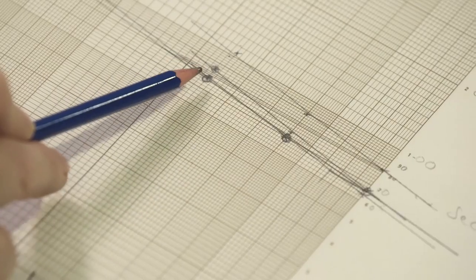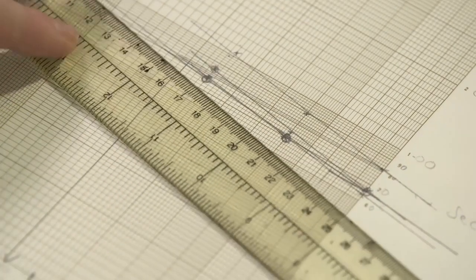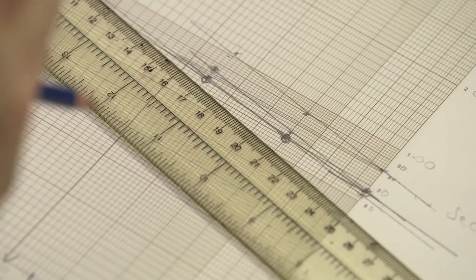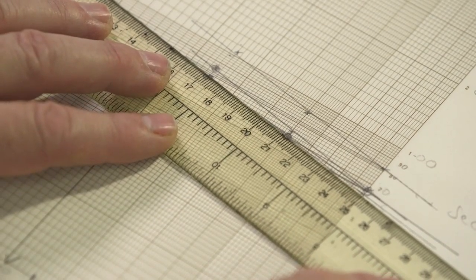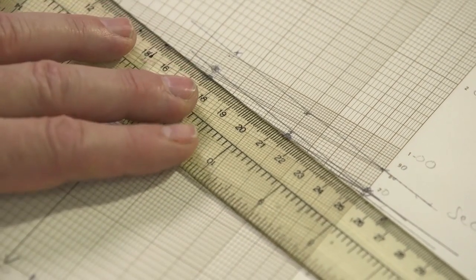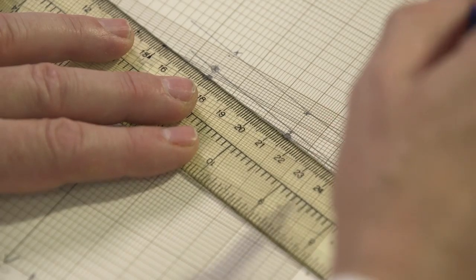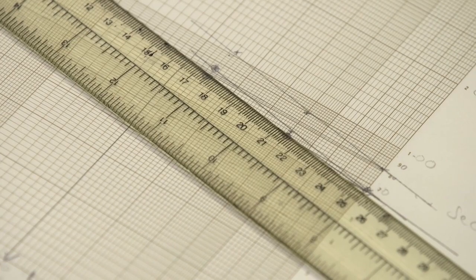Just double checking the clotting times. Yeah, almost practically exactly on the calibration line. And therefore, both giving a straight line parallel to the standard. So from those two, we could conclude that actually the concentration is 100% of the concentration in the reference material, 100% of 94 international units per deciliter.